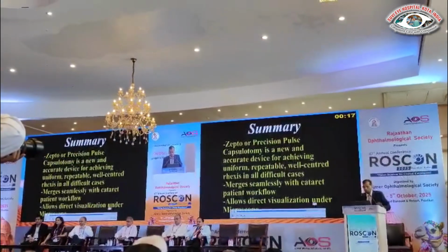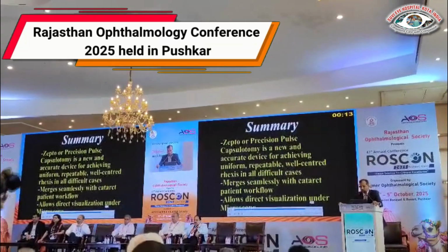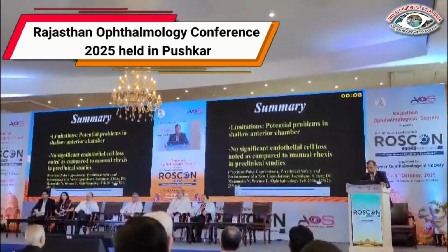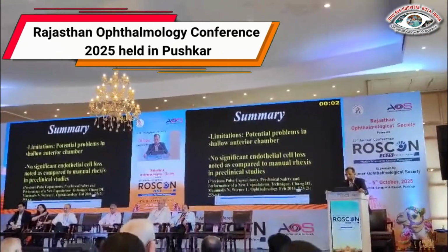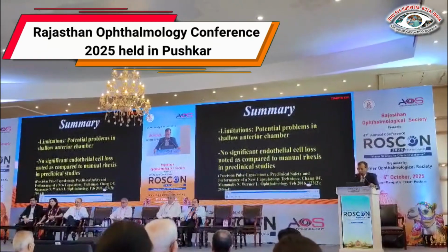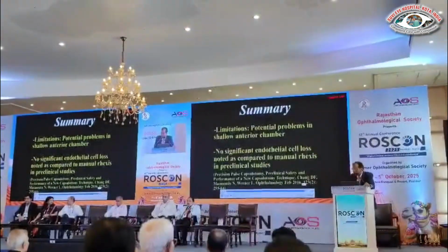So this device is very helpful to create a capsular access in challenging case scenarios such as hypermature cataract, Morgagnian cataract, and pediatric cataract. The downside is that you have to be careful inserting the device in cases like infants and children, and coat the endothelium with a high density or cohesive viscoelastic such as Viscoat. Thank you very much.